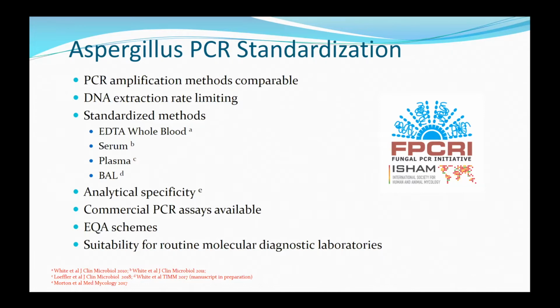Commercial PCR assays are available. Many of these are CE marked. Most of them, I can't really think of any that are currently FDA approved, which is a problem for gaining access to Aspergillus PCR in the US. But we do have external quality control assessment schemes, EQA schemes, which puts us on par with most other molecular diagnostic tests.